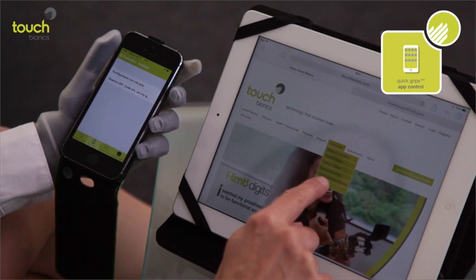All right, so what she's doing here, just so I can explain what's happening, is on our website, we have a bunch of QR codes of different grips that users have submitted. So as a user makes a custom grip, maybe they make something for a unique tool at work, or of course we get all sorts of sign language gestures that we don't put on the website. But the ones that are helpful, we put them on our website, and that allows the user to connect the app and scan the QR code and add one of those grips to their hand.